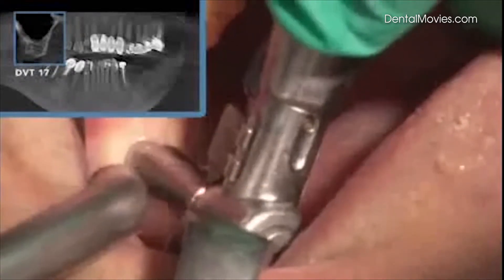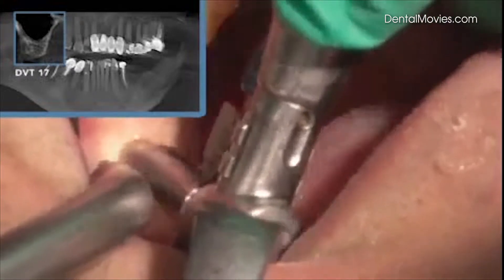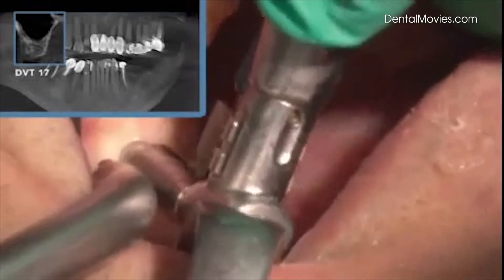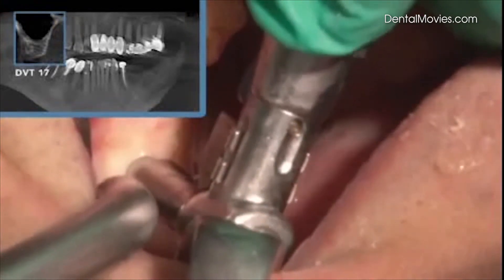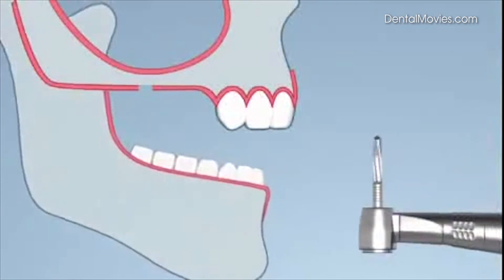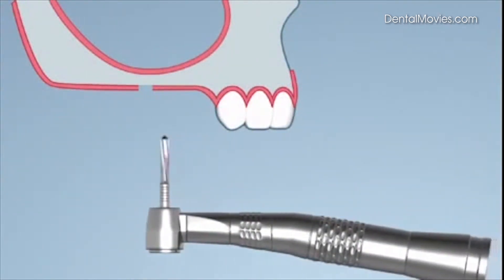Punching of the mucosa with the ATP punch, developed by Professor Wolfgang Jesch. The blind hole is drilled up to 2 mm below the sinus membrane floor, up to 3-wall.